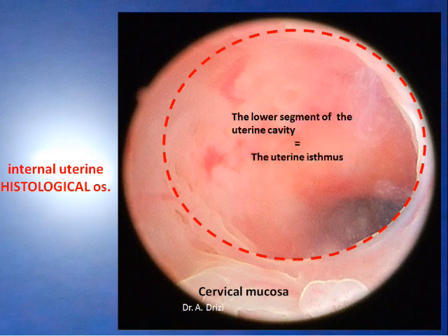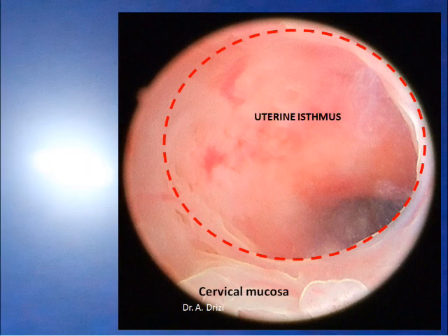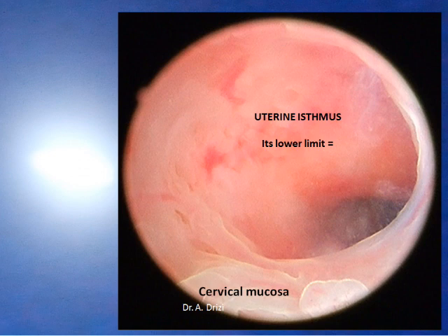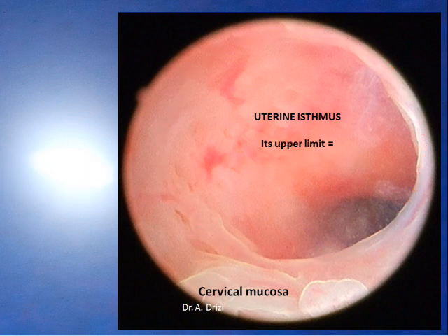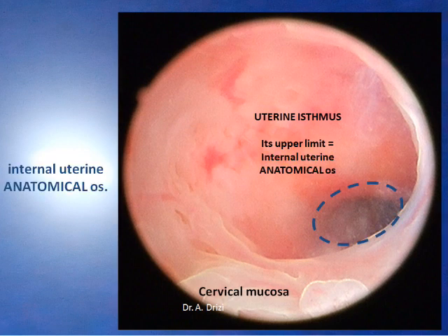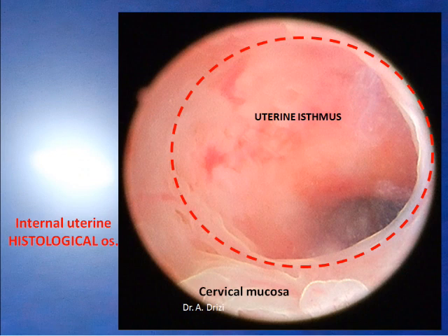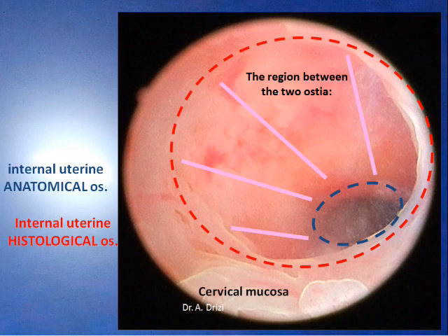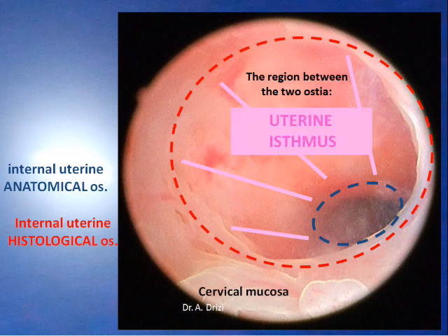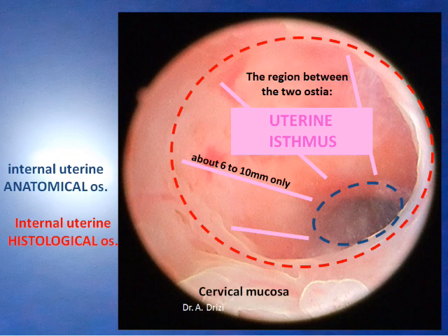The lower segment of the uterine cavity is the uterine isthmus. Its lower limit is the histological ostium, and its upper limit is the internal uterine anatomical ostium. The region that lies between the two is the uterine isthmus — about six to ten millimeters only.